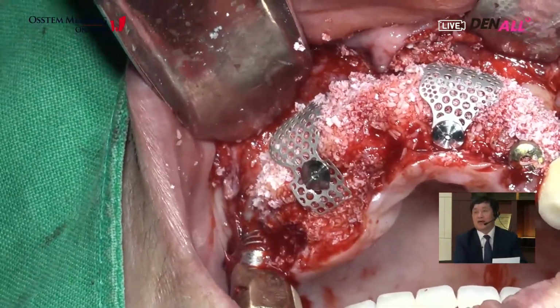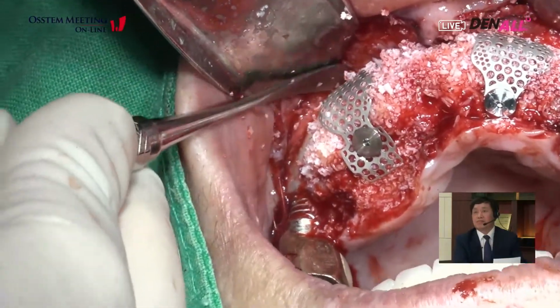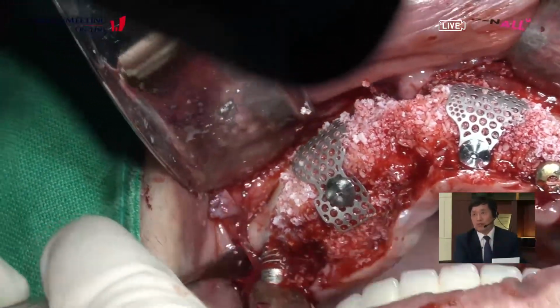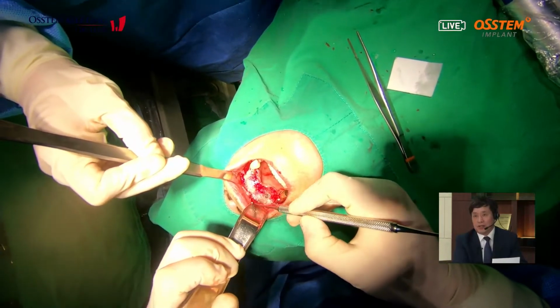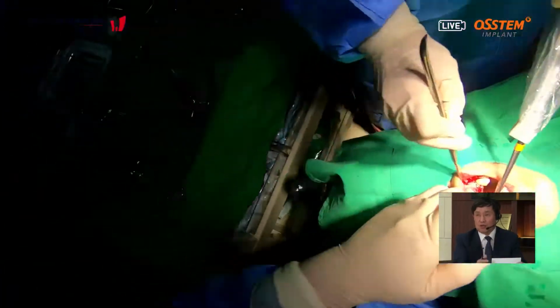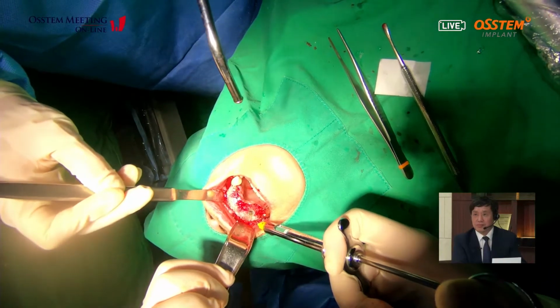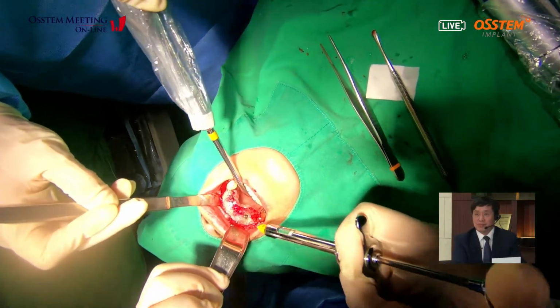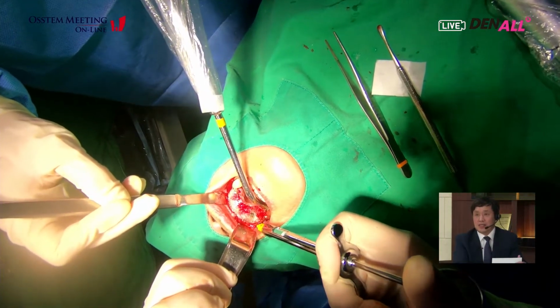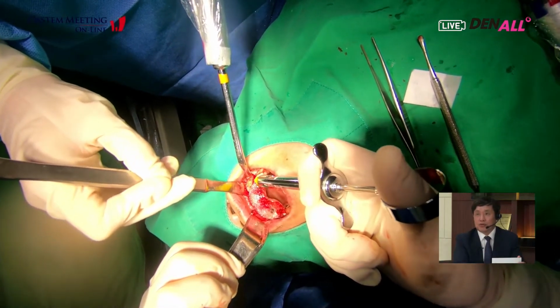Before placing the Ossguide, I will advance the buccal flap to get a tension-free primary closure. He will do the periosteal releasing incision for closure of the wound with primary healing without tension. In the major mucosa area, this patient feels some pain. The patient is slightly painful on the labial side. He gave more local anesthetic for pain control.